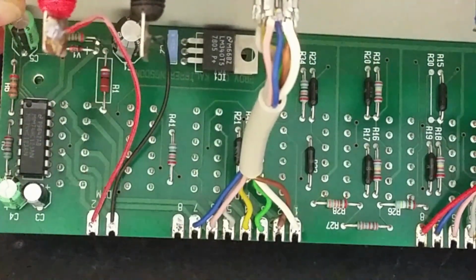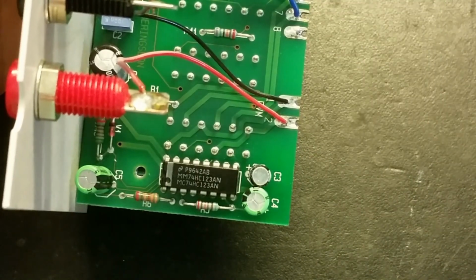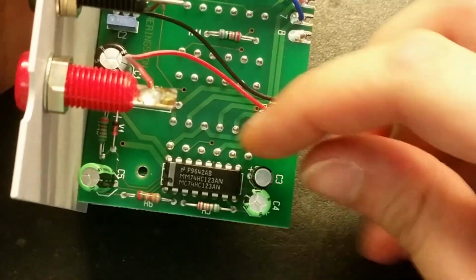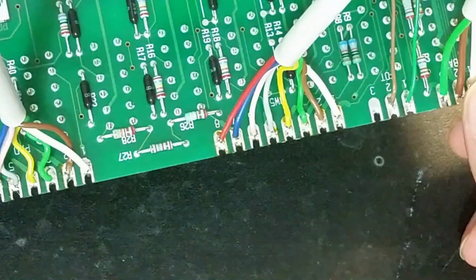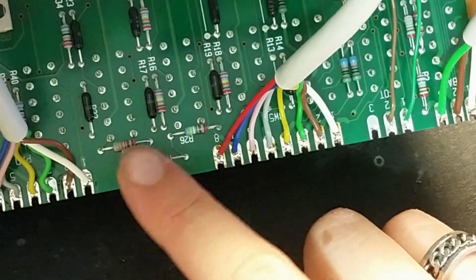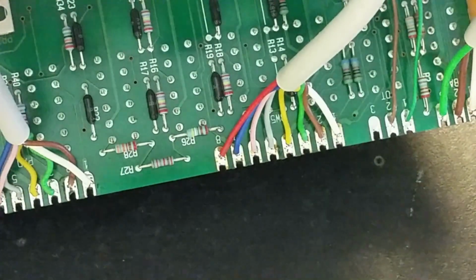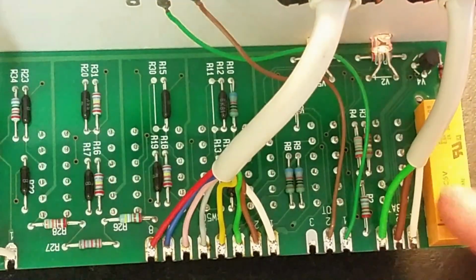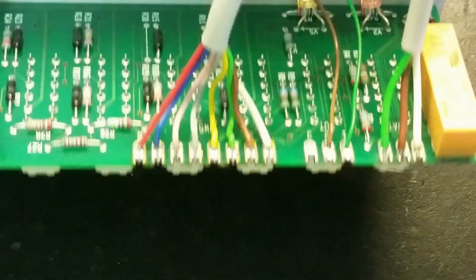There's a 5-volt regulator. And here's a 74123AN, which is a retriggerable monostable multivibrator. So that's some kind of oscillator here. Got these capacitors and some resistors around it. And here on the switches, we've got some resistors. And in parallel with them we've got this black thing, which I think is some kind of precision resistor. And here we've got a relay, a transistor that drives the relay, and 2 LEDs, and that's more or less about it. Not so much actually here.